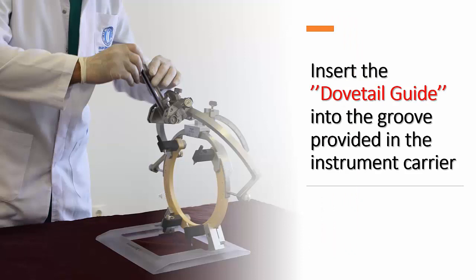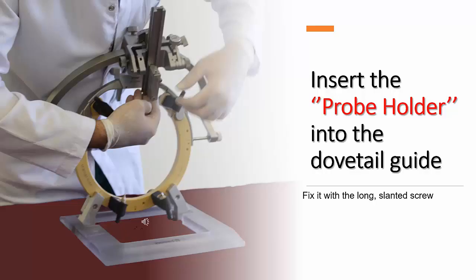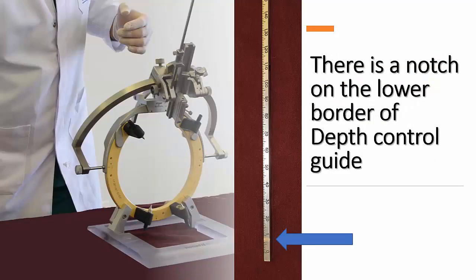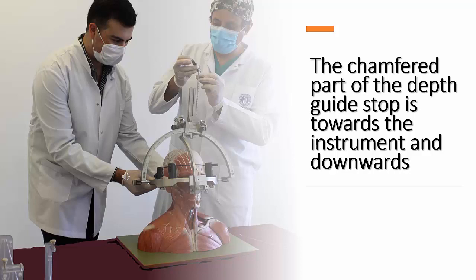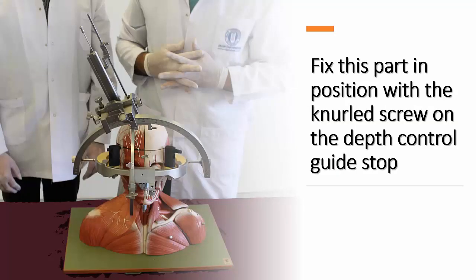Insert the dovetail guide into the groove provided in the instrument carrier and secure the carrier with the knurled screw on the outside. The instrument holder can then be inserted into the dovetail guide, then fix it with the long slotted screw. Insert the depth control guide into the square aperture on the left side of the instrument carrier. There is a notch on the lower border of the depth control guide that needs to sit in the square aperture — push it until a clearly perceptible engagement occurs. Then place the depth control guide stop up to the depth control guide and push it. The chamfered part of the depth guide stop faces towards the instrument and downwards. Fix this part in position with the knurled screw on the depth control guide stop.